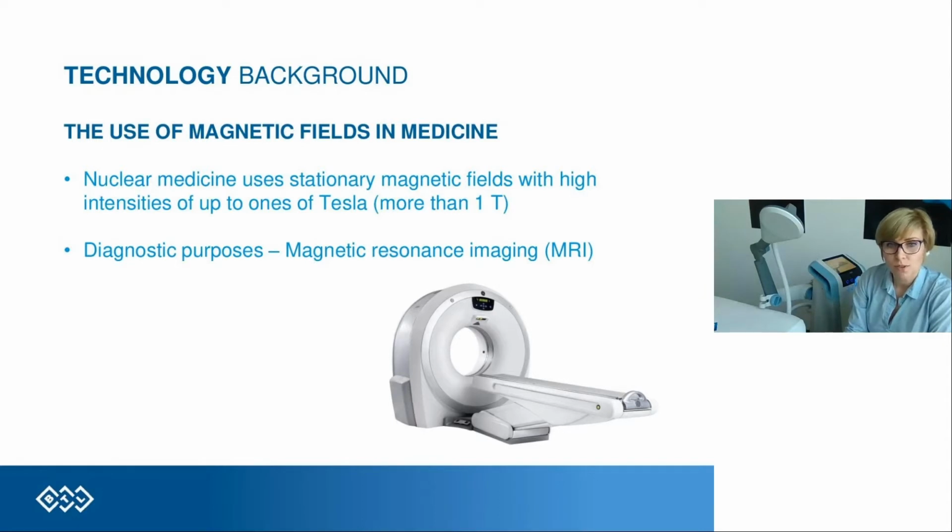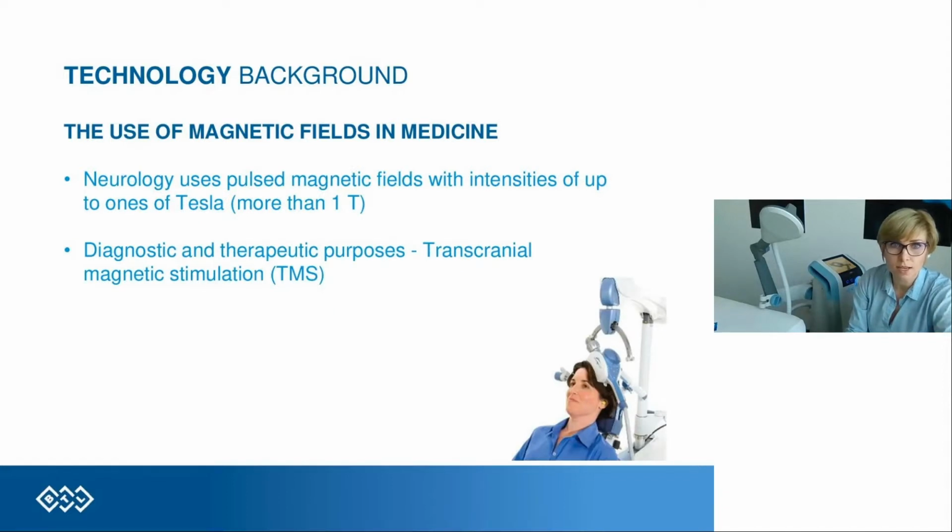So let's go through the technology background, because the magnetic field is well known in medicine. The most common topic that comes to mind is that magnetic fields are used in MRI for diagnostic purposes, and there we are using stationary magnetic fields. Where we also use magnetic fields is in neurology, and this is a very common topic as well. And we are using it with transcranial magnetic stimulation.